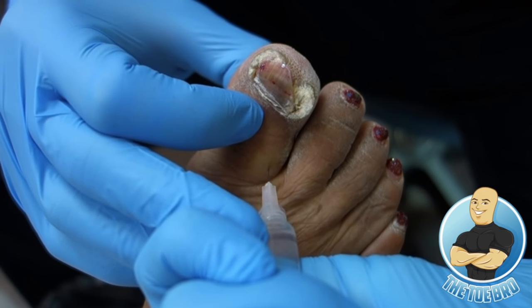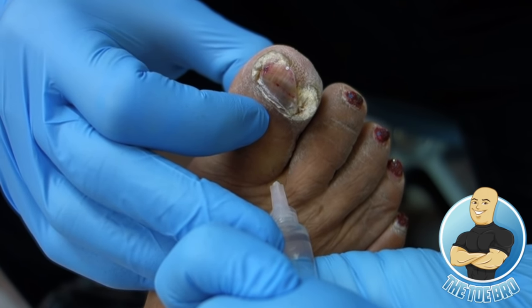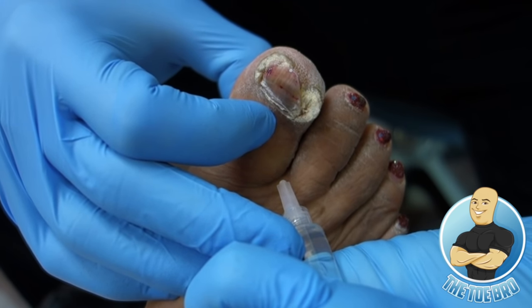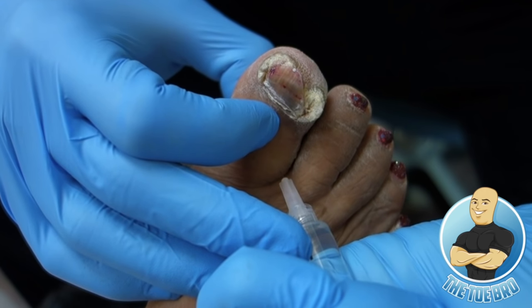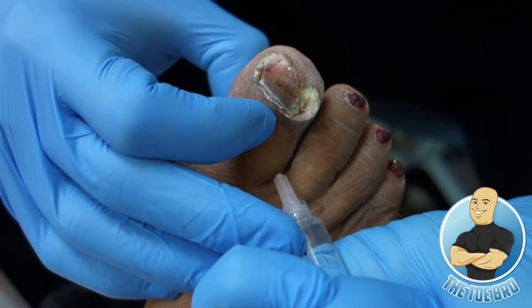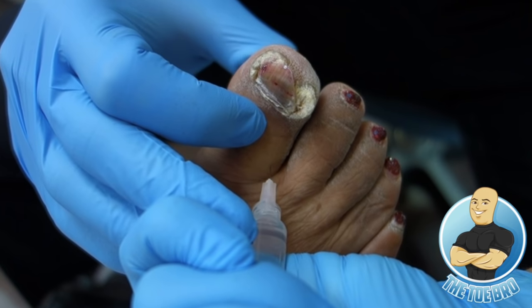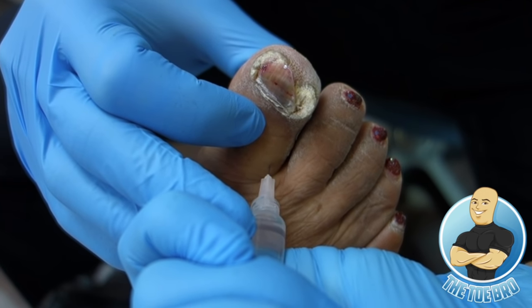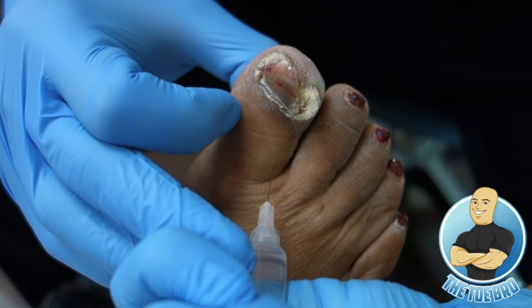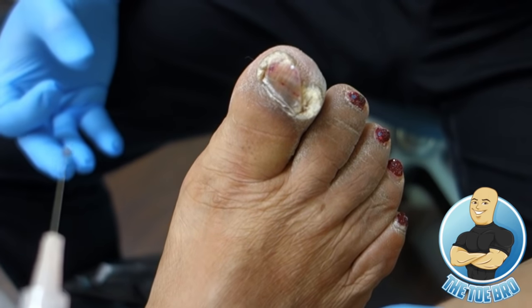So what we're doing today is we're numbing the toe so it's completely numb. She doesn't feel anything. We are going to surgically remove the warty tissue. I'm also going to remove the thickened, damaged fungal toenail. I'm going to use electricity to kill any warty tissue left behind. And then I'm going to use a chemical called phenol to, again, make sure there's no warty tissue left behind. And then also apply that to the nail matrix. And that should hopefully stop the nail from ever growing back.